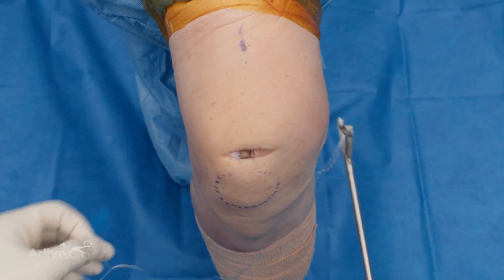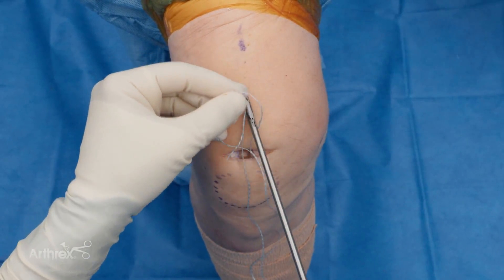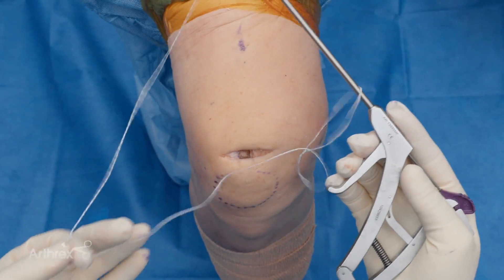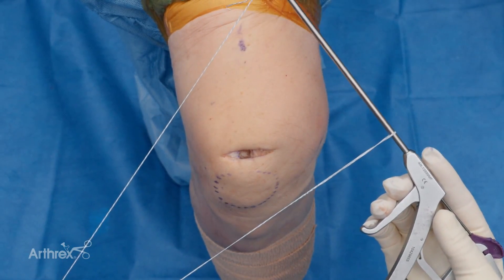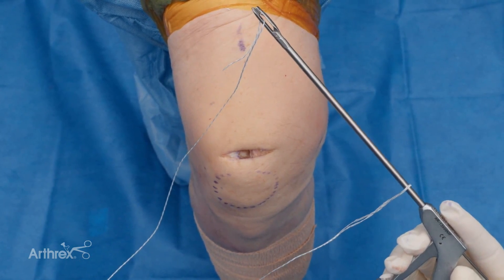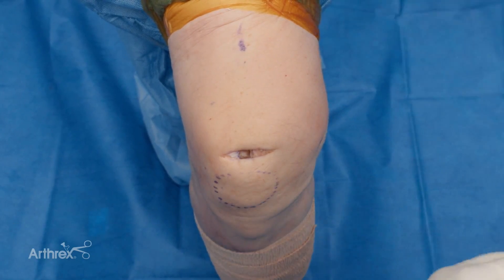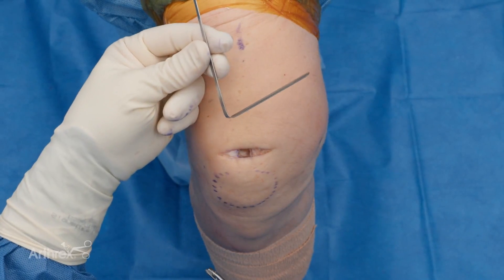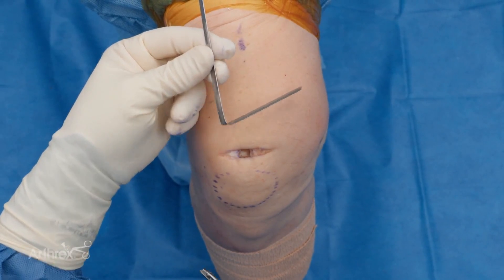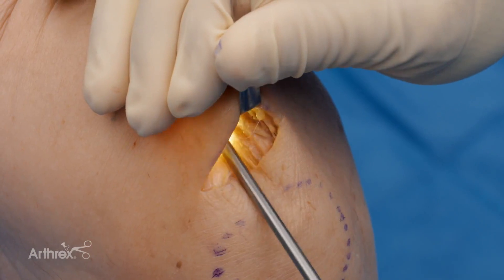Then you'll take the fiber link — the loop part, so this is the fiber link loop here — and you're going to pass that over the neck of the scorpion and create basically a loop on this way. What this does is it allows the first pass through the tendon to become a luggage tag. We're going to go ahead and take the meniscal skid that we took from our meniscal repair set, and this works very well. We're going to slide that underneath our quadriceps tendon.